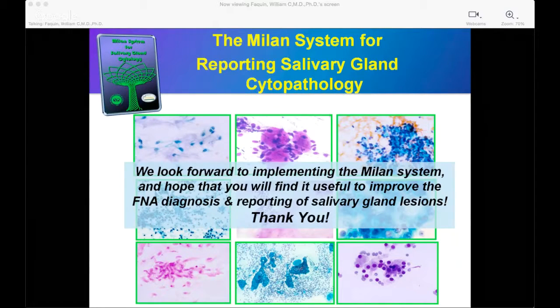Distinctive cytologic features for squamous metaplasia. That's actually a little bit difficult to answer because it really depends on the nature of the sample and the nature of the lesion. Squamous metaplasia can occur in such a wide range of entities in the salivary gland, from non-neoplastic conditions such as chronic sialadenitis.